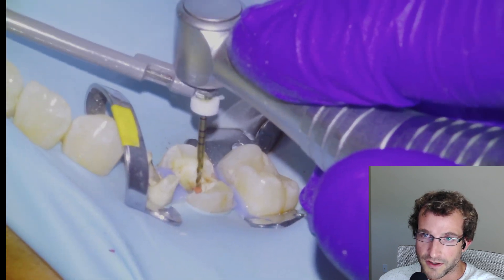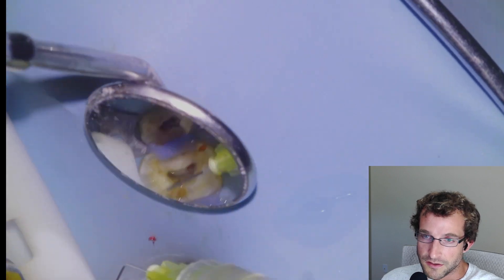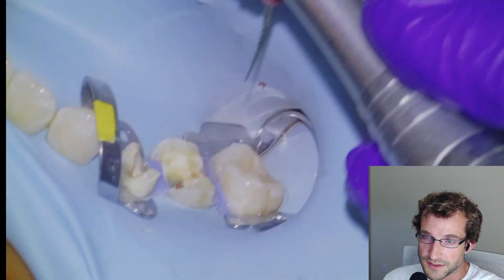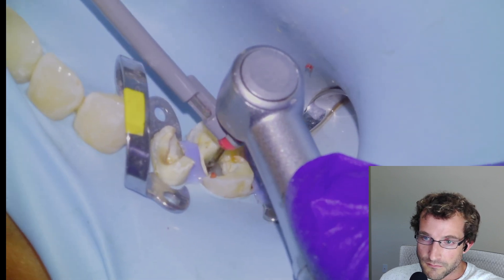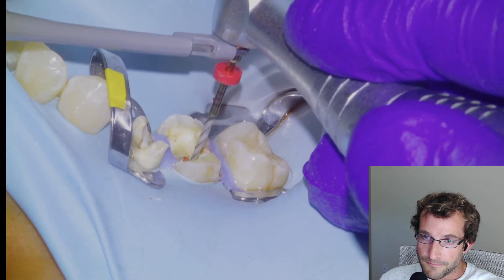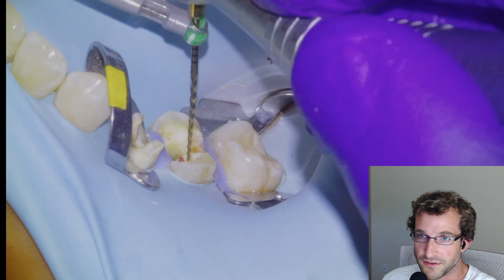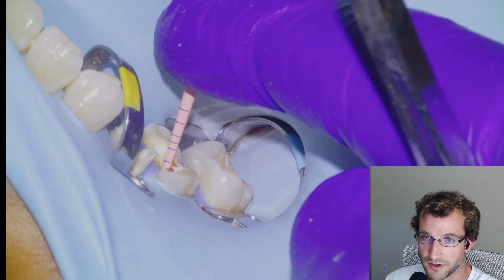We'll irrigate and then continue with our file sequence with the apex locator clipped — irrigate, continue instrumenting. This is a 2504 that we'll take down to length in all five canals. Quick endo because of the open canals. I'll speed through this a bit. Lots of active footage for this case so I'm going to fast forward. This is the final file, the 3504, and then we're going to try some cones in.